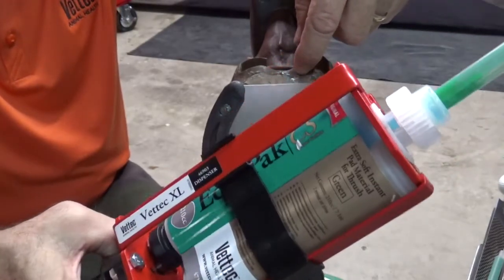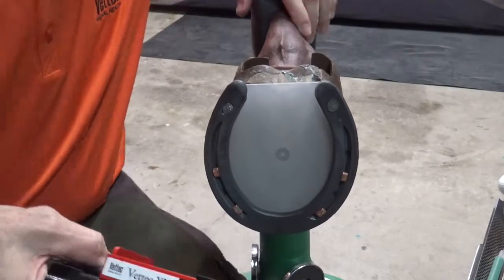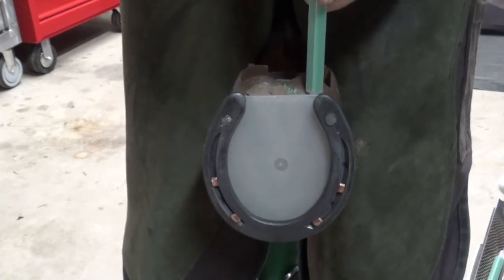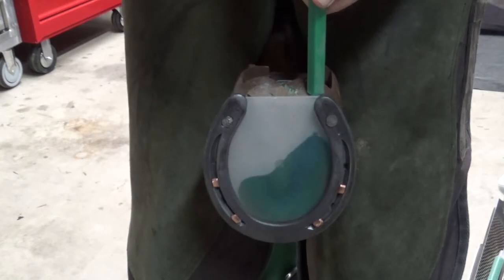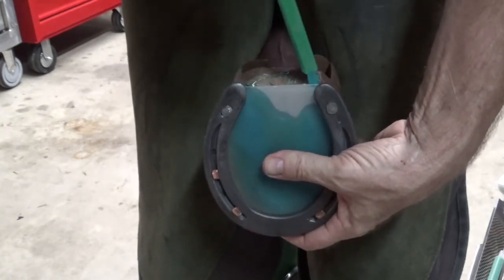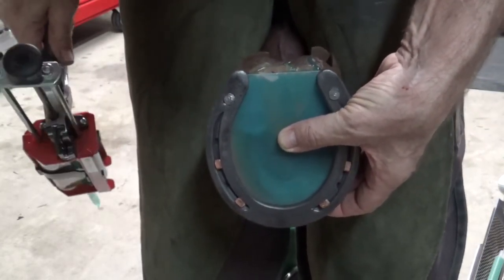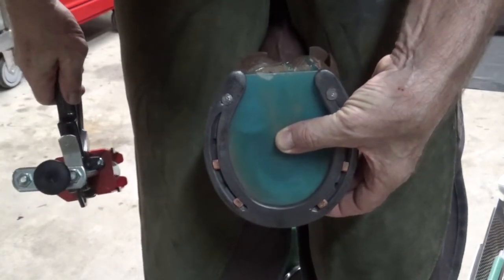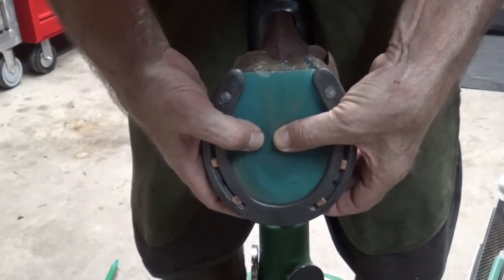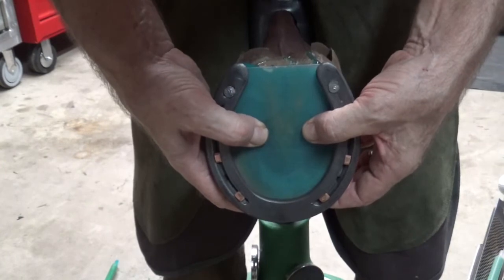We're using a Vettek Equipax CS, so it's teal colored, and you'll be able to see the contrast through this clear Kirkhart pad. You really just need to hold this at the heels and fill it one side. You can take it out and move it to the other side, and press on it to expel out any air. That gives you a complete fill. You can see that there's no voids — it's actually completely filled the toe and flowed there without any problem. Now, if this were a very flat foot, as I mentioned, we would be drilling holes in the pad and filling it that way. But I think this is going to work 90% of the time just fine, and it's nice that you can see that every area is filled completely.